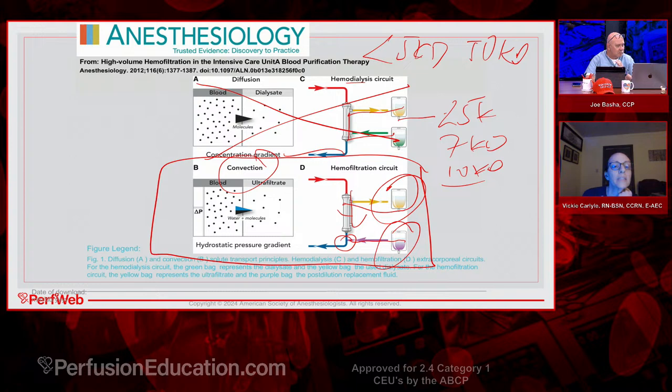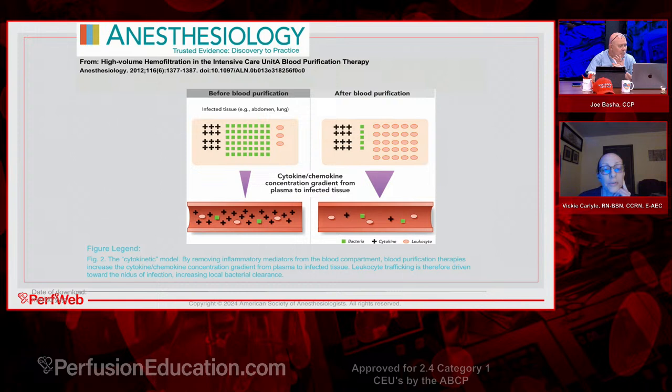Okay, fair enough. The only way that you can remove something that large is to add that immense pressure gradient. So you don't even necessarily have dialysate on the other side of that membrane. You actually have the fluid in the tubing with the blood going at a rate that can create that pressure gradient instead of a concentration gradient. You need a very high transmembrane pressure and use a pump only to control the volume as it is being pushed through the pores. And that solvent drag is what allows a dialysis membrane to remove very large structures.